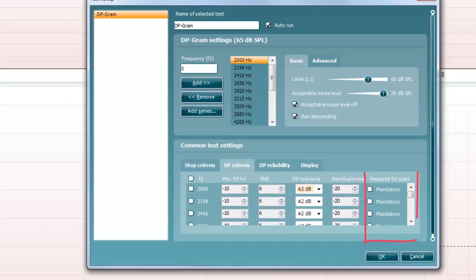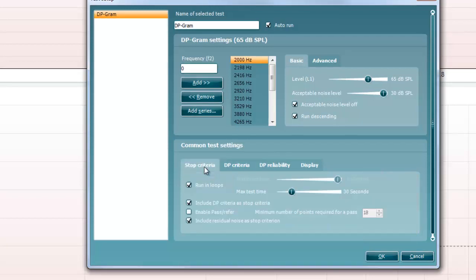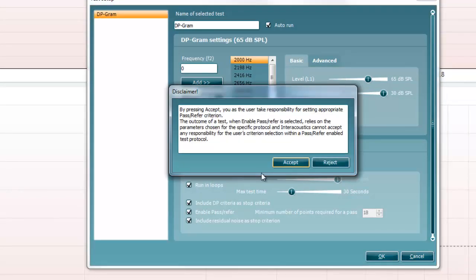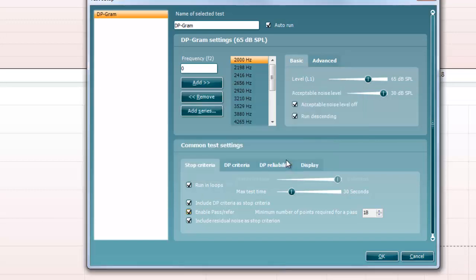Required for pass is when you define which measurement points are mandatory to reach a pass when Enable Pass Refer is checked for an overall result.